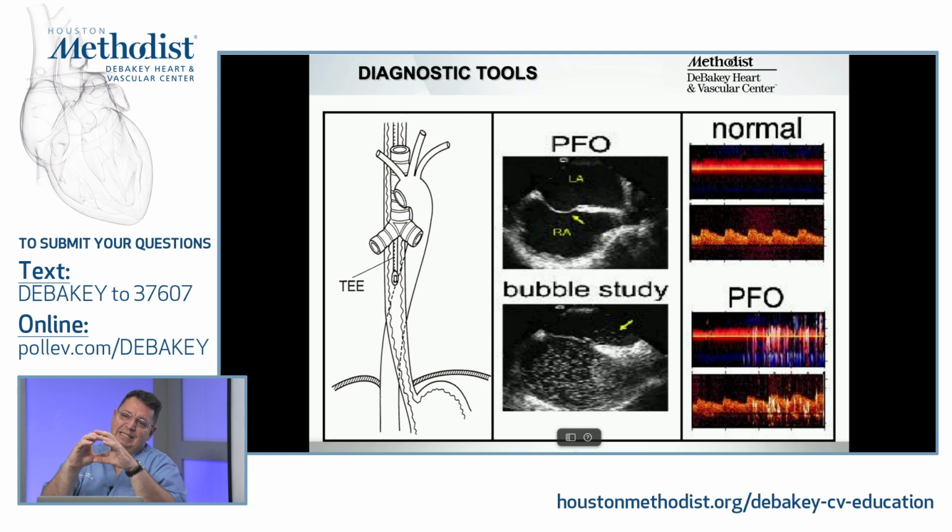While the TCD is monitoring a 3D flow volume with all that sample, usually something like 9 millimeters, and your vessel is 3 millimeters or maybe just 2 millimeters. So you are definitely over-detecting all the 3D flow that you have in the middle cerebral artery. So this is one of the advantages of having a 3D versus a 2D view of your flow. And the second one is that you will see some examples when we do Valsalva. You don't see anything on echo.